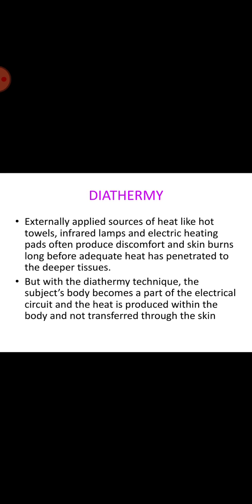For their action, surgical diathermy machines depend on the heating effect of electric current. When high frequency current flows through the sharp edge of a wire loop or band loop or the point of a needle into the tissue, there is a high concentration of current at this point. The tissue is heated to such an extent that the cells immediately under the electrode are torn apart by the boiling of cell fluid. The indifferent electrode establishes a large area contact with the patient, and the RF current is therefore dispersed so that very little heat is developed at this electrode. This type of tissue separation forms the basis of electrosurgical heat cutting.